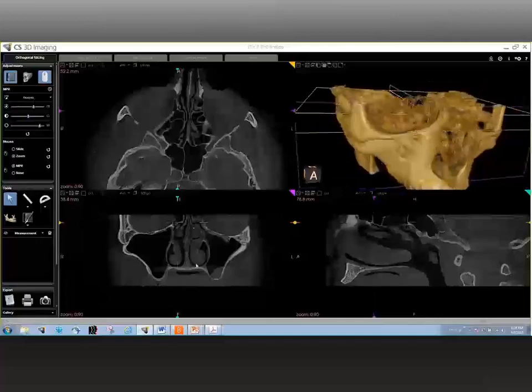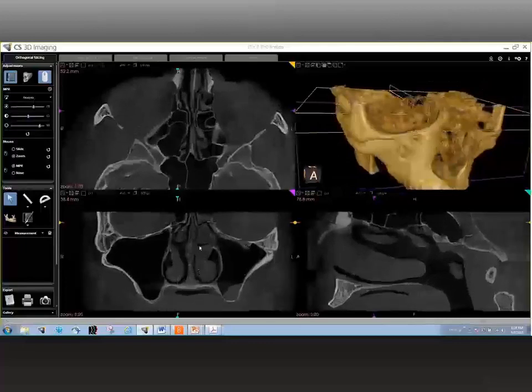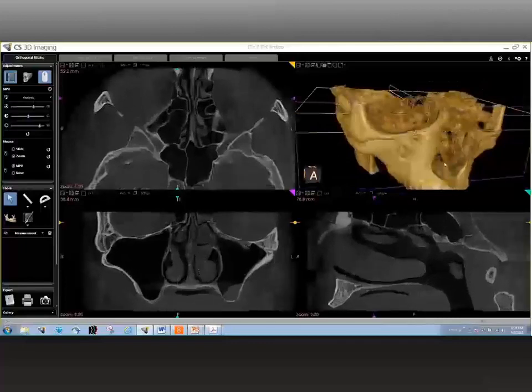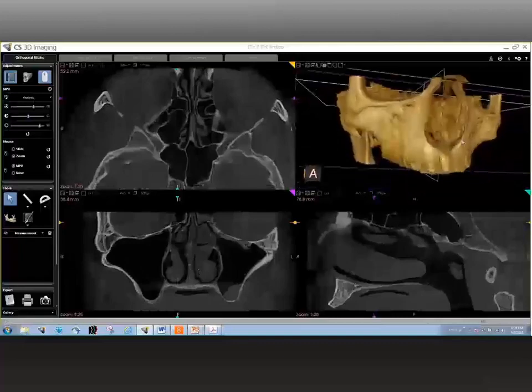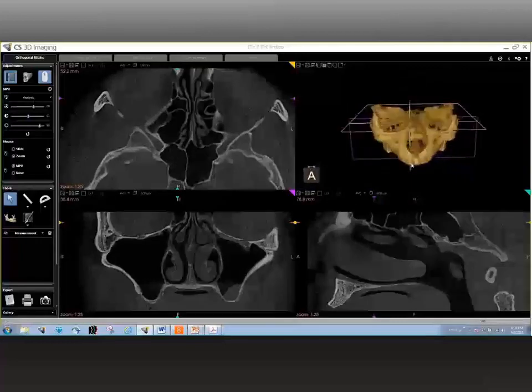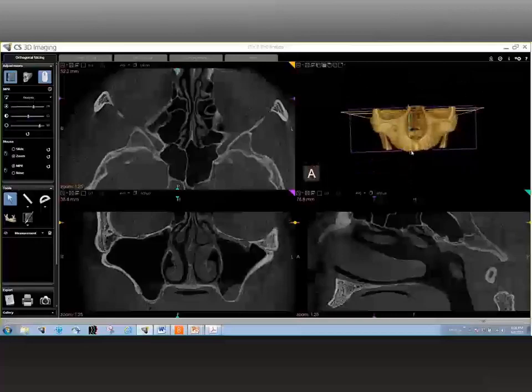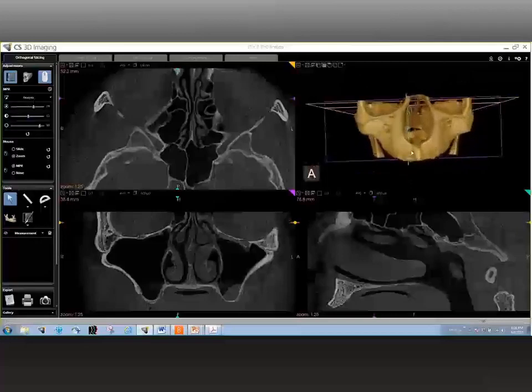Well, that's a very good question. Sinus health is important to discern, and to distinguish any sinus disease from pathology of odontogenic origin. What I am trying to say is that there could be some pathology located in the sinus which may not be due to a problem that originates from the sinus. It could originate from the jaw and then transmit itself into the sinuses, or vice versa. That could happen the other way around too.